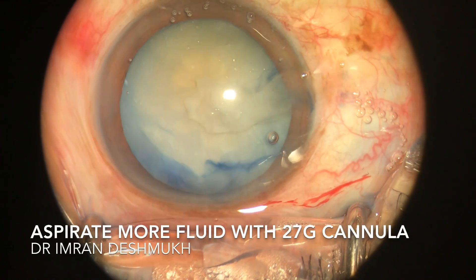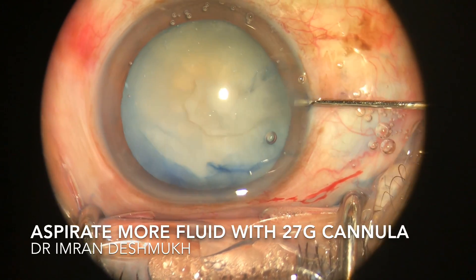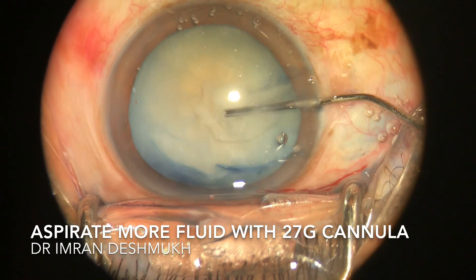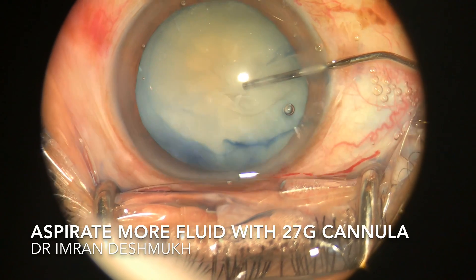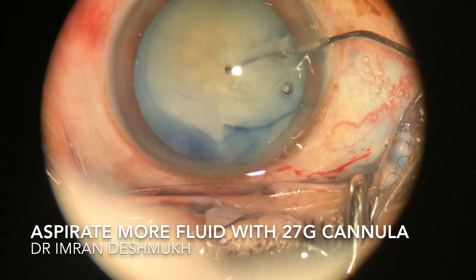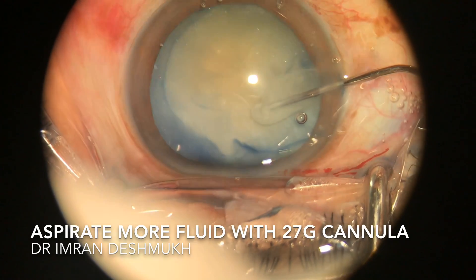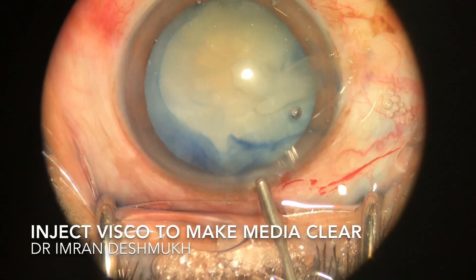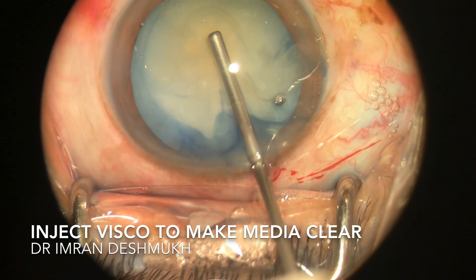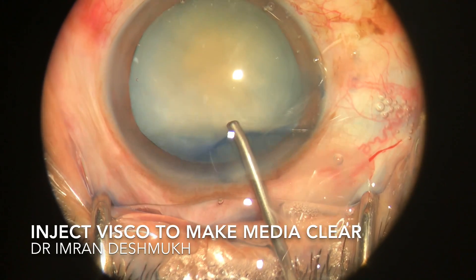Once you find the rest of the fluid in the anterior chamber, slowly insert the 27 gauge blunt cannula and aspirate as much fluid as you can. Be slow, be steady, and try not to go inside the anterior capsule as it may extend. I use a lot of viscoelastic to clear the media.